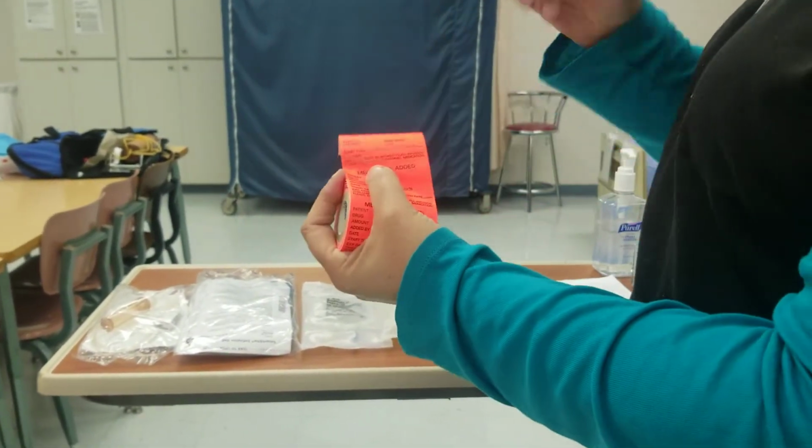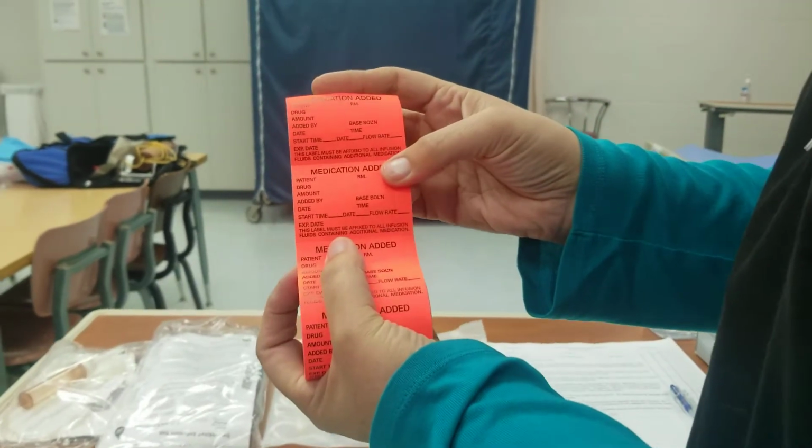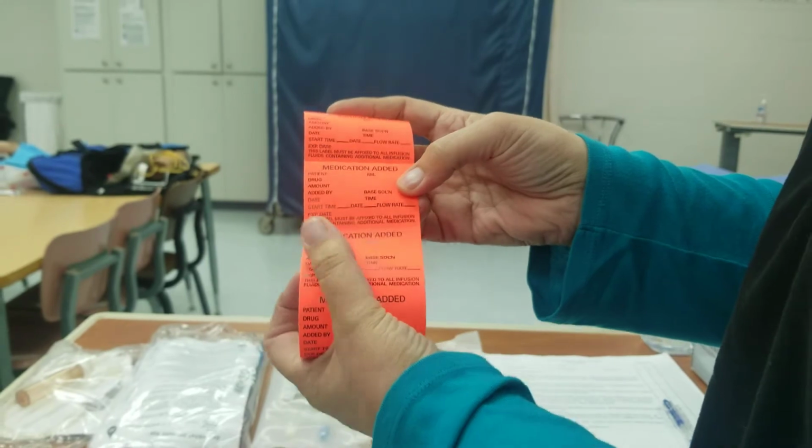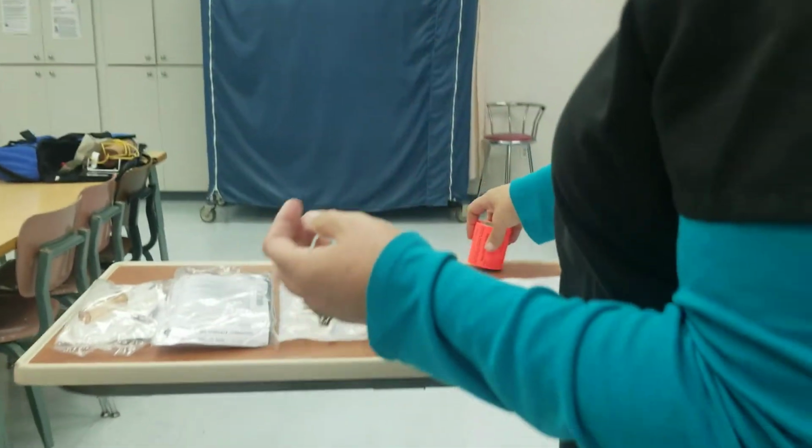And then, of course, we've got the labels. So you put the patient's name. You're identifying your medication and making sure it's labeled and going to the right place and everything. So I'll show you how to fill that out.